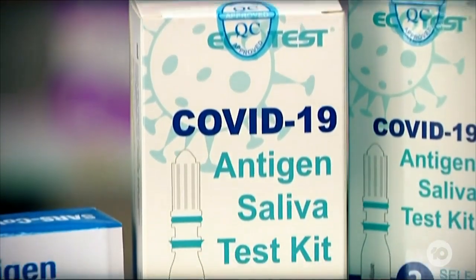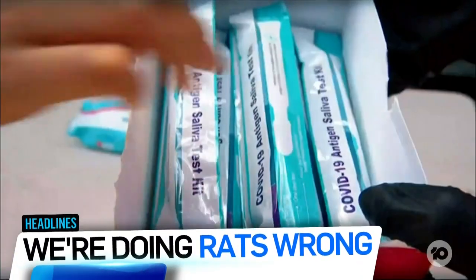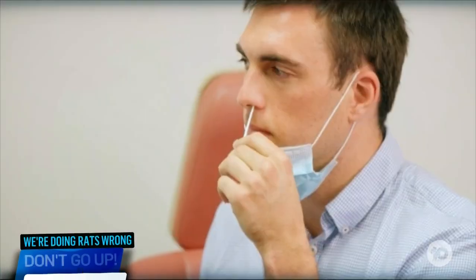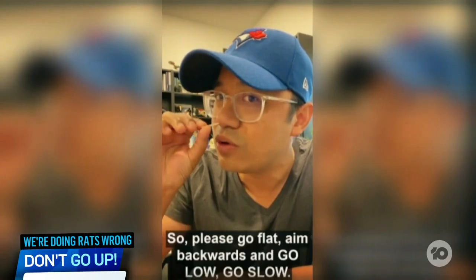By now, we all know that rapid tests are the way forward with the Omicron outbreak, if you can get your hands on them. But it turns out that most of us are doing it wrong. One Melbourne doctor's how-to video has gone viral. In it, he demonstrates how exactly it should be done.